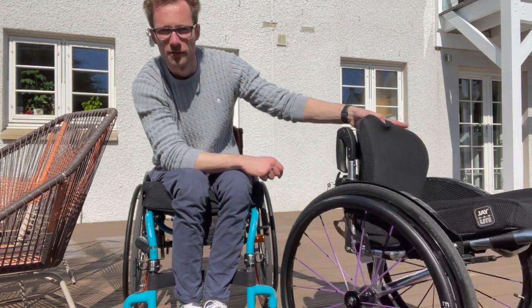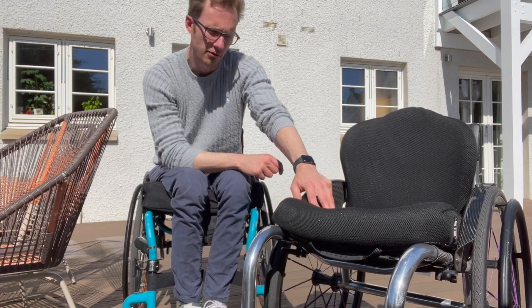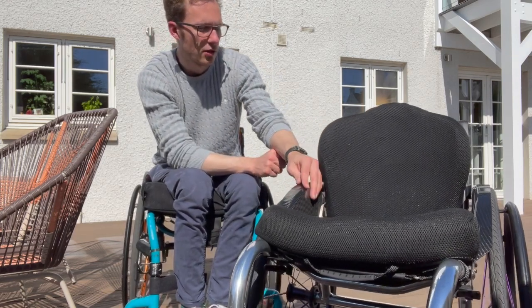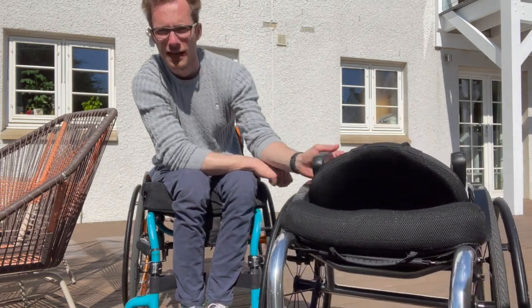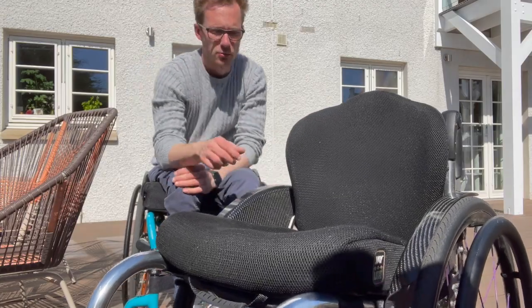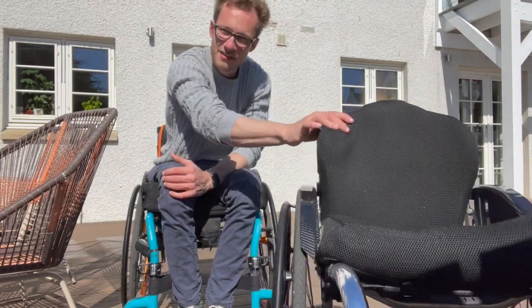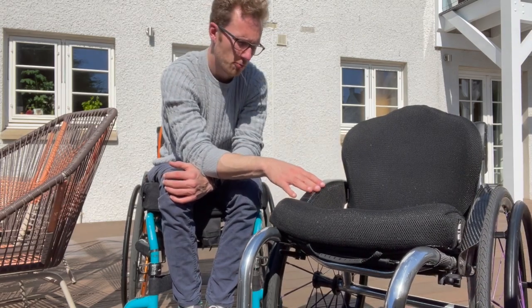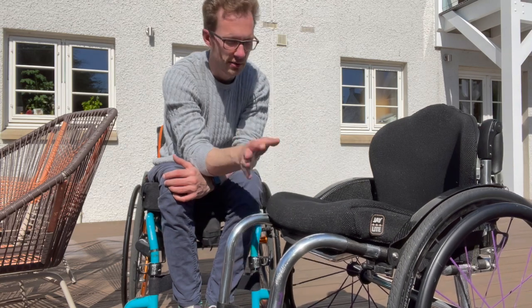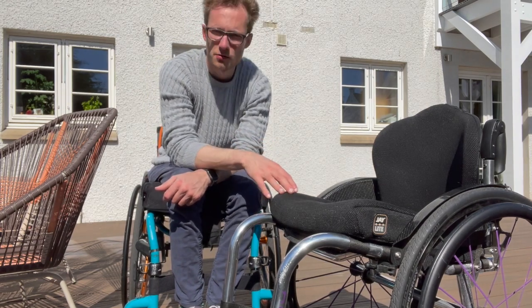It's called a Sub 4 because without the wheels and cushion the frame is supposed to weigh in at less than 4 kilograms. I think that's true if you don't add any extras — for example, this backrest folds and that folding mechanism adds weight, these handles likely add weight, and the J3 backrest adds weight too. So my Sub 4 is actually a Sub 5 — I weighed it recently and it comes in at about 4.9 kilograms, which is still respectable but not quite Sub 4.